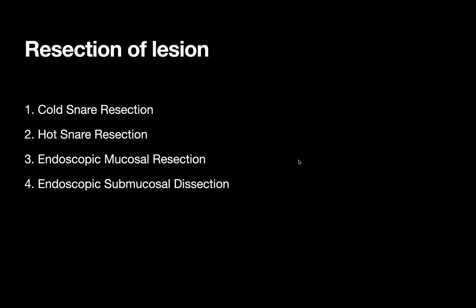And in this case, as it evolves, you would realize why a cold snare resection would have been a bad choice. And Roy has discussed the reasons why cold snare resection should not be used in a case like this. Of course, you should use cold snare for all small polyps, and that's part of our guidelines as well. All right, thank you, Roy. Okay.